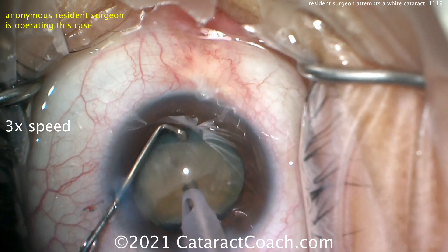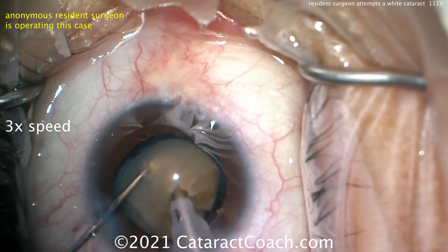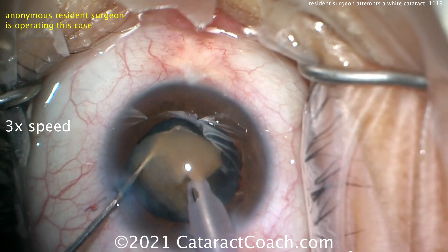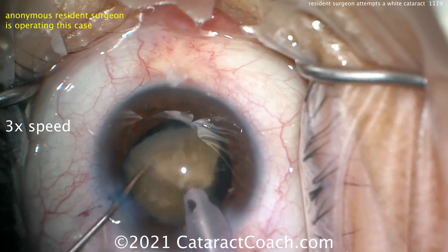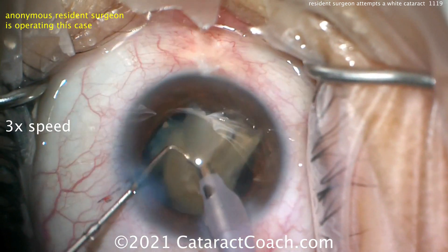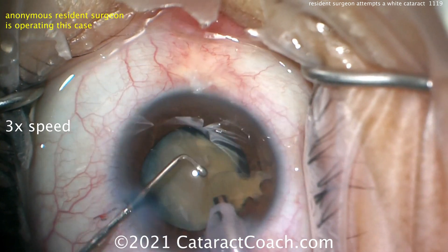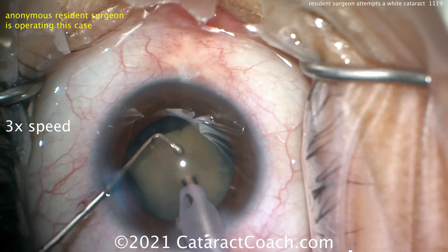You can see there's one hemi-nucleus left in the capsular bag. I'm staying in the primary position the whole time — really nice job. Going to the side of the nucleus, bringing it up, and chopping the corner off. Remember, it's easier to chop off a small corner than to go in the middle and try to split it in half, especially with a denser nucleus. It's coming out quite nicely.